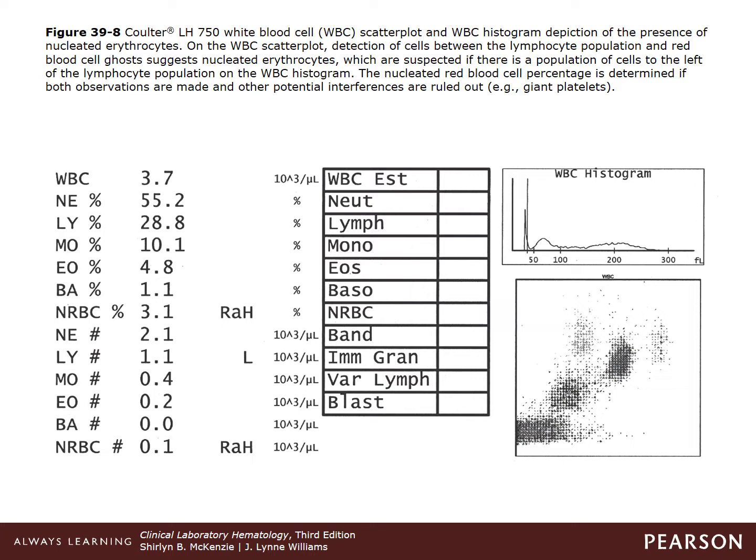The one above are monocytes. This larger darker group are neutrophils, and you can see the darker the group, the more cells are within the group. And then this lighter category are eosinophils. And in the bottom here to the left are nucleated red blood cells, or some kind of ghost population or debris that has to be looked at under the microscope.